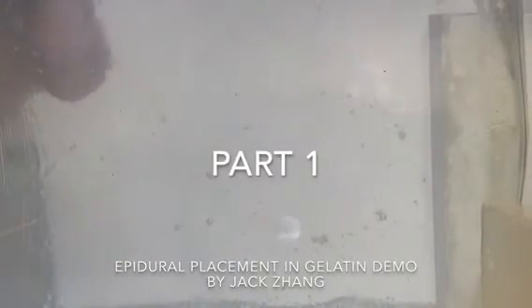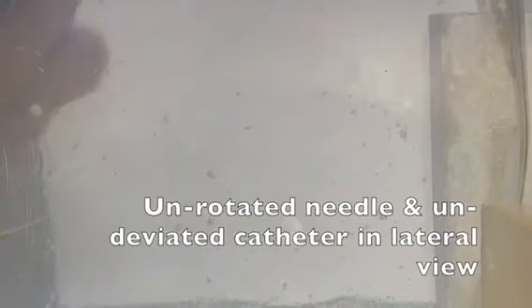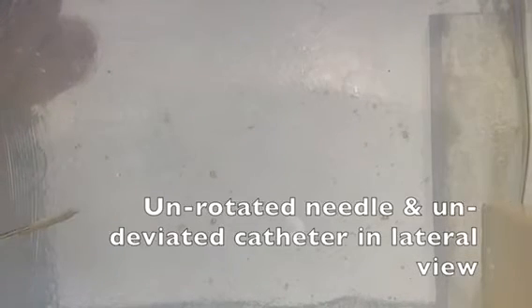Now I puncture the skin through different layers until I find the epidural space by loss of resistance to normal saline. Now assume I find the epidural space.